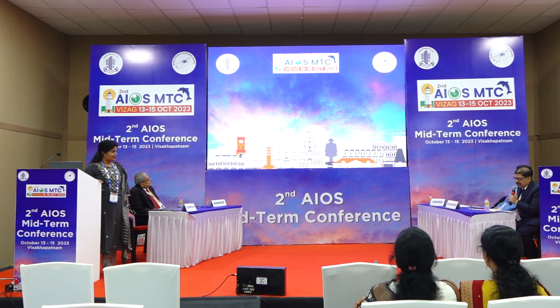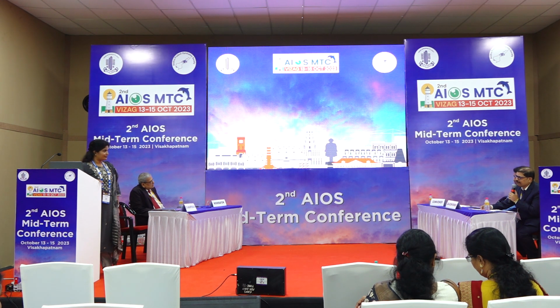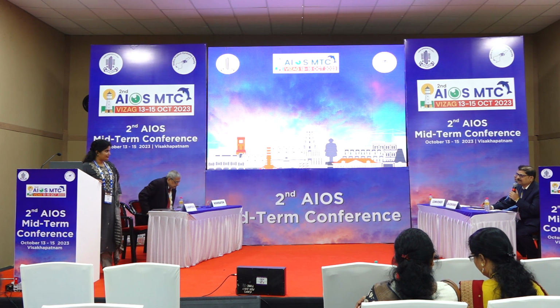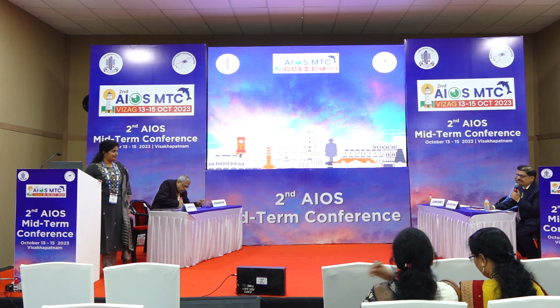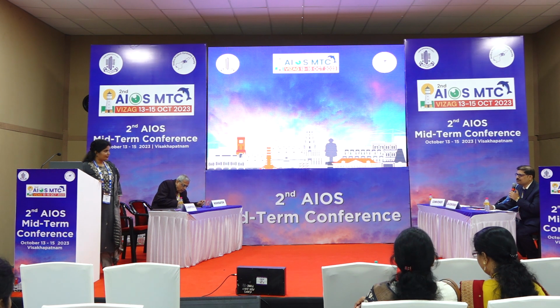So in all the formulas for IOL calculation, which is the one factor which cannot be measured by the existing machines? The effective lens position. That cannot be assessed by any machine that is available right now.